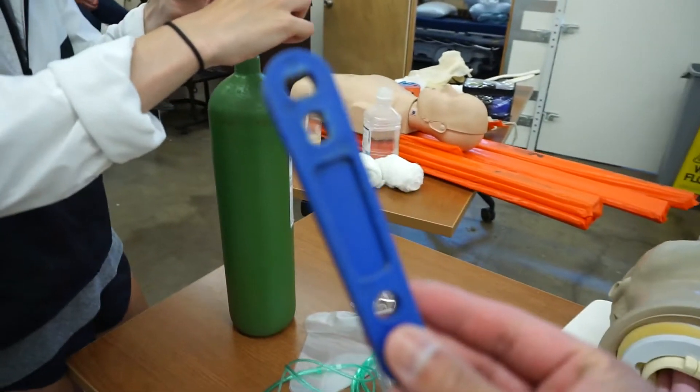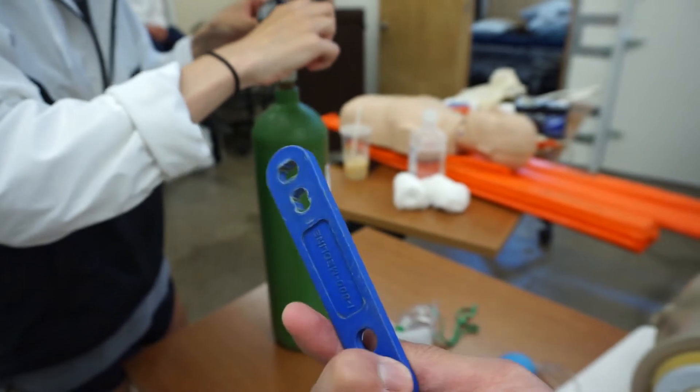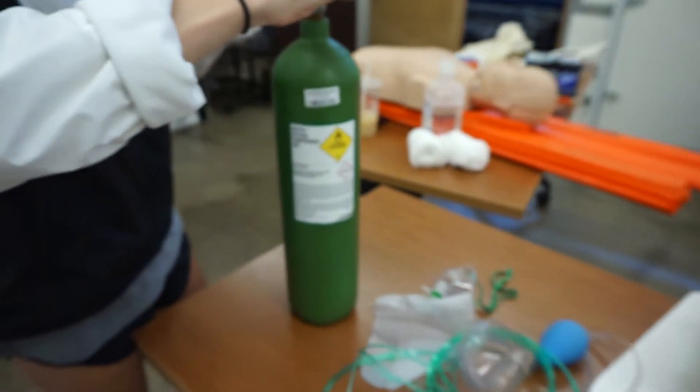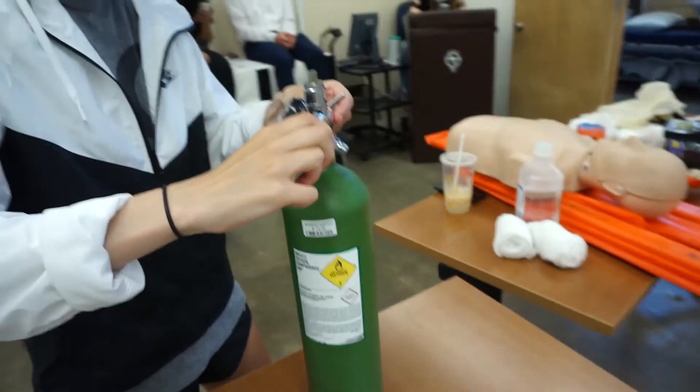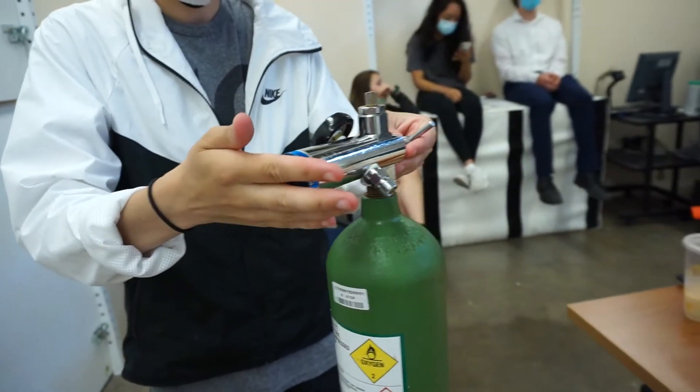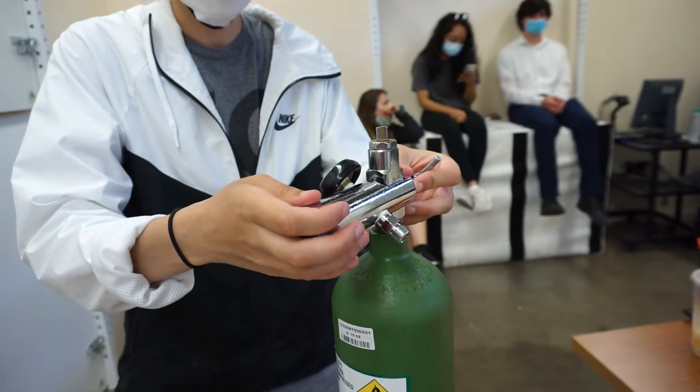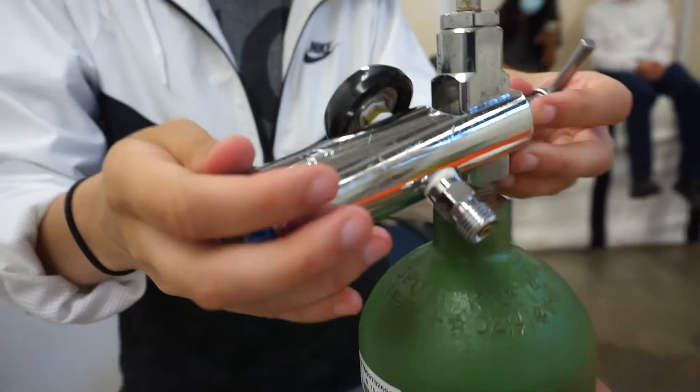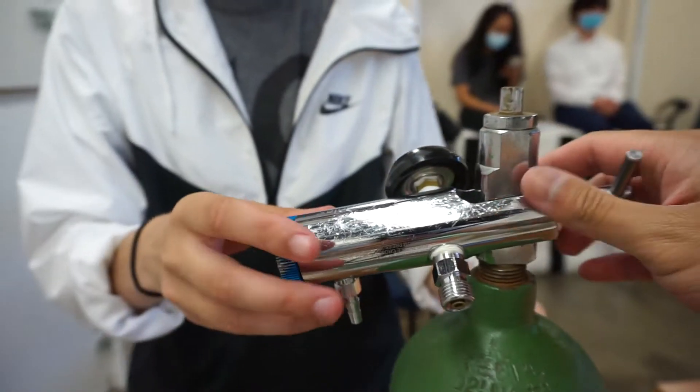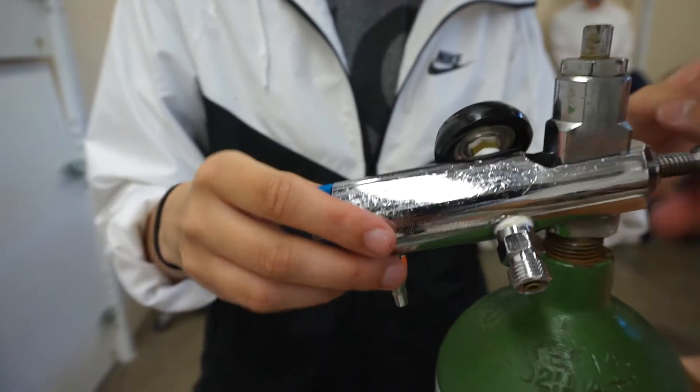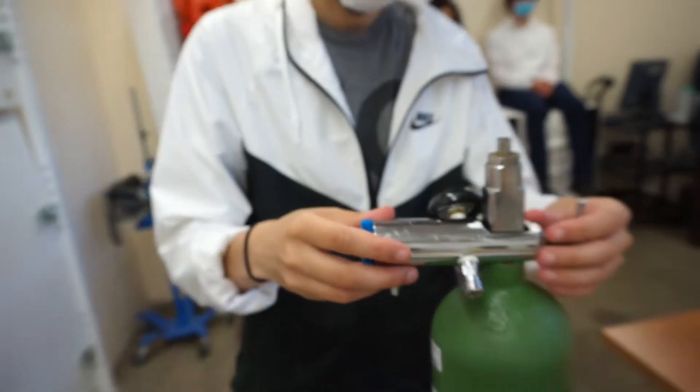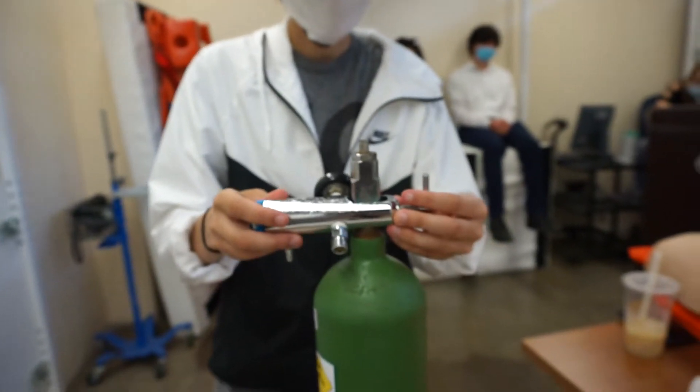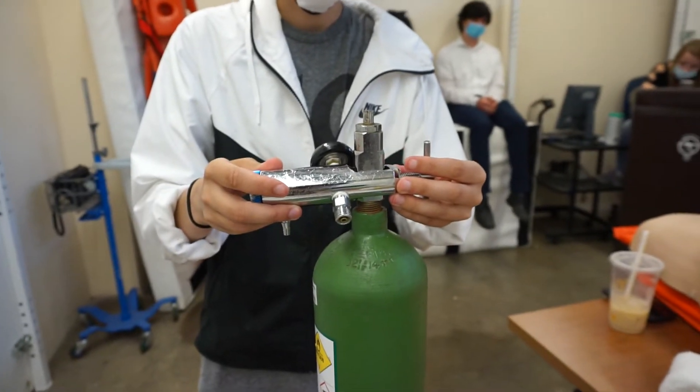And then the third piece of equipment you'll need is going to be an O2 key. Alright, so just by looking at it, sometimes it's crooked, sometimes it's too low, and you think it's right. And if you were to continue tightening this and then open the tank.